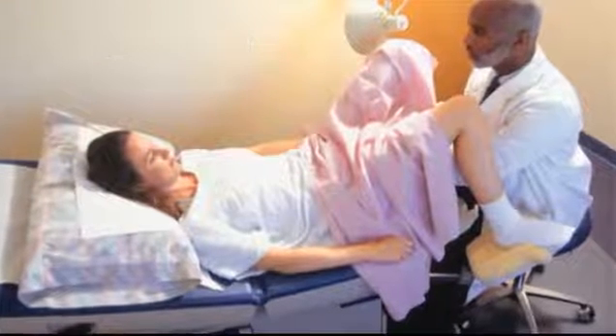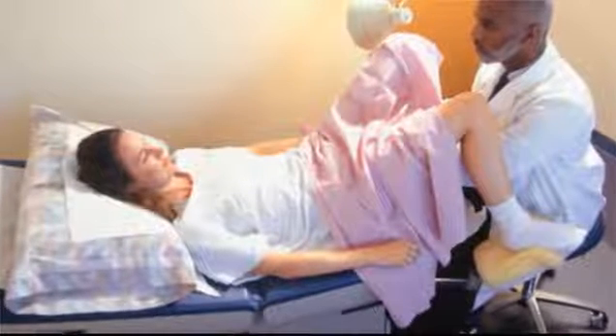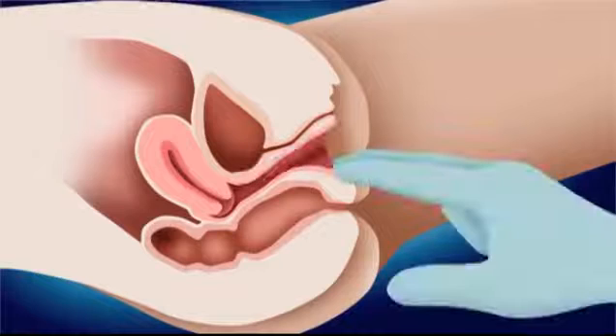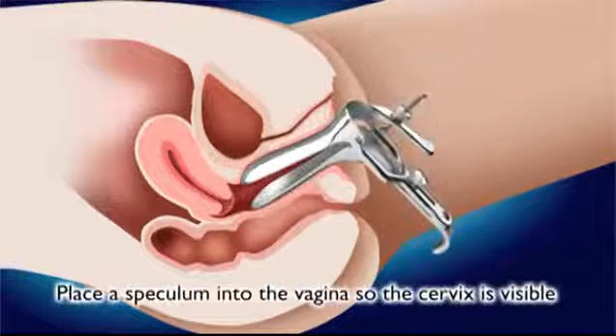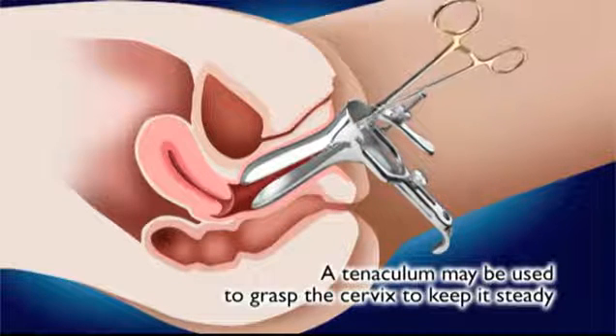The procedure requires the patient to lie on the examining table in a position similar to that used to obtain a Pap smear. First, a manual exam will be performed to determine the position of the uterus. Then a speculum is placed in the vagina to open it and keep it open so the cervix is visible during the procedure.